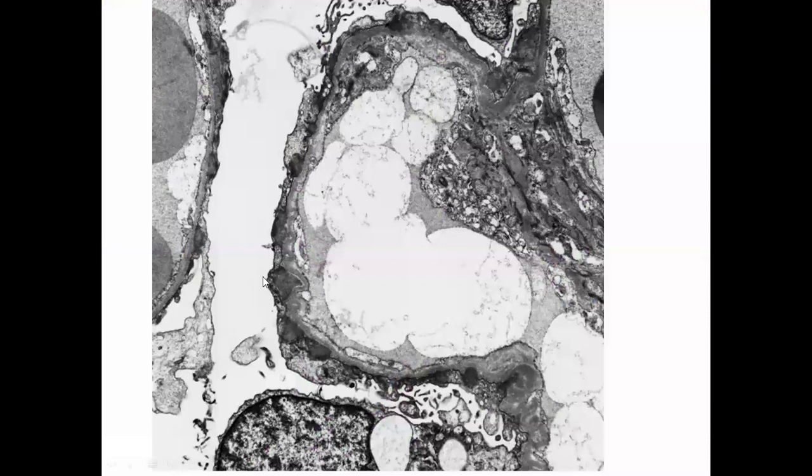So when I say subepithelial deposit, this is the GBM. I use the terminology glomerular basement membrane here because I am looking at ultrastructure, at the electron microscope. So here is the GBM. What you can see here are these dark colored things. These are electron dense deposits. And this is the podocyte cytoplasm.